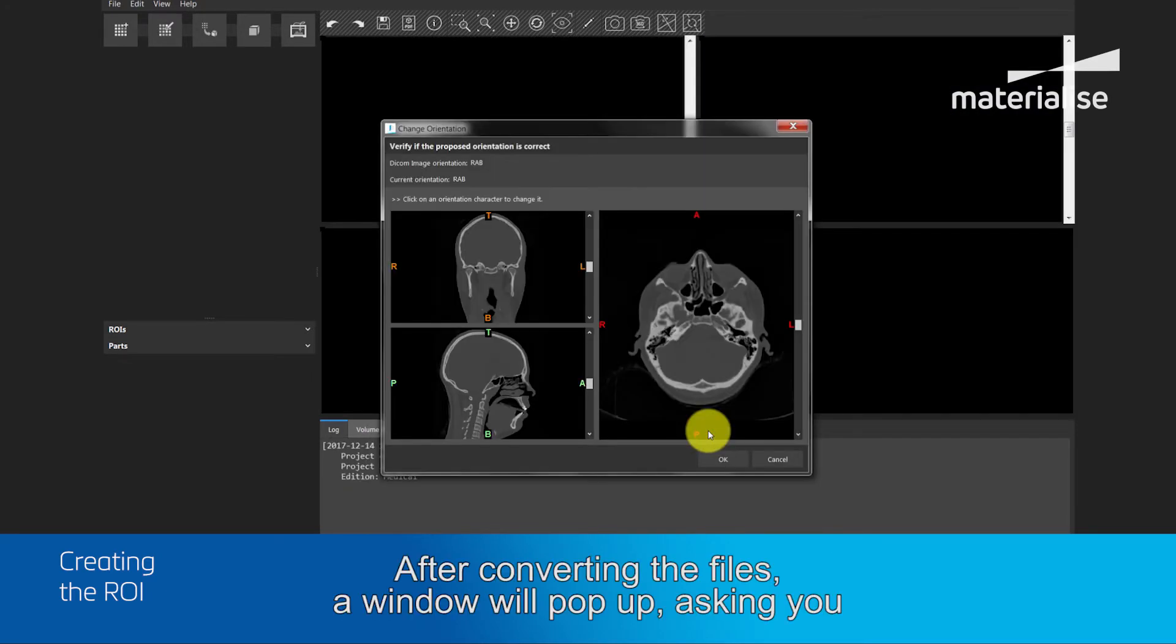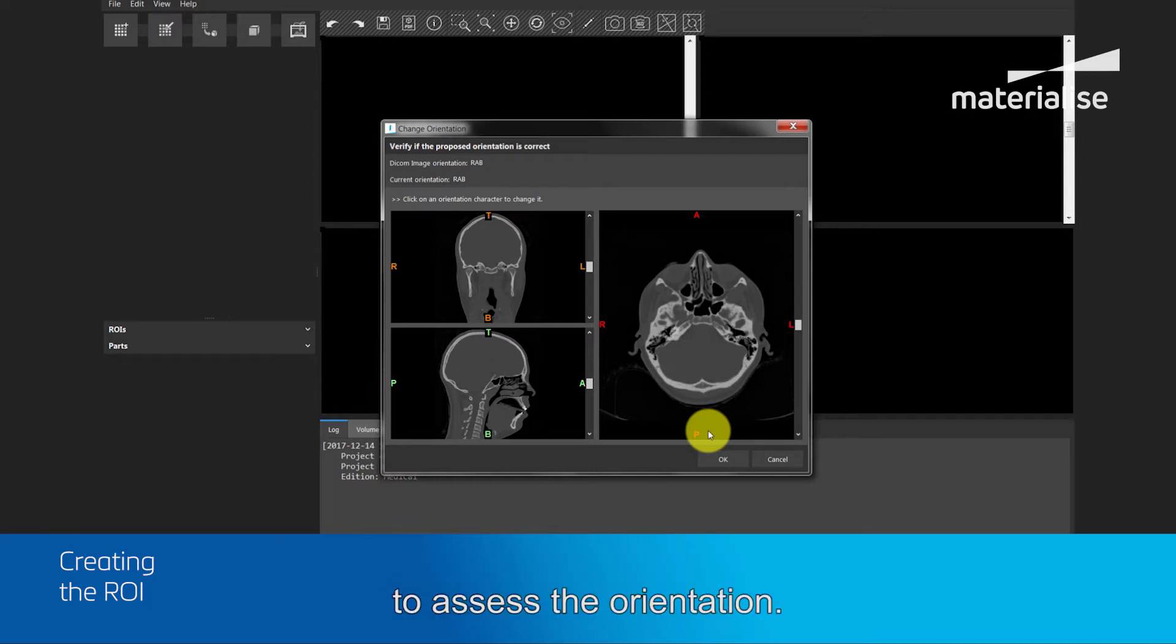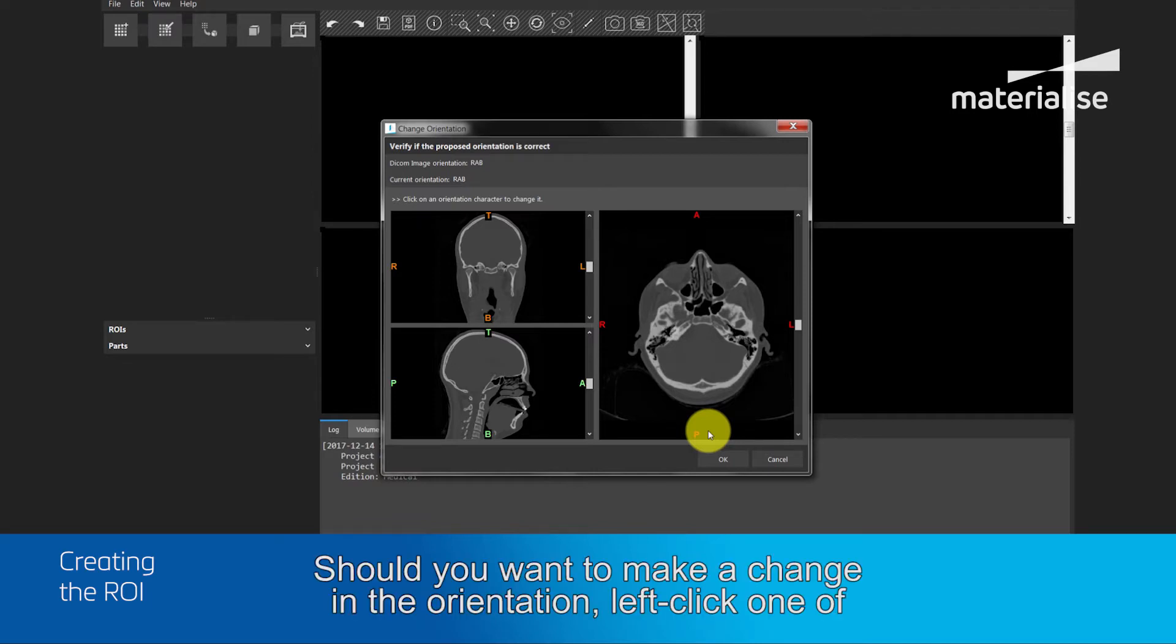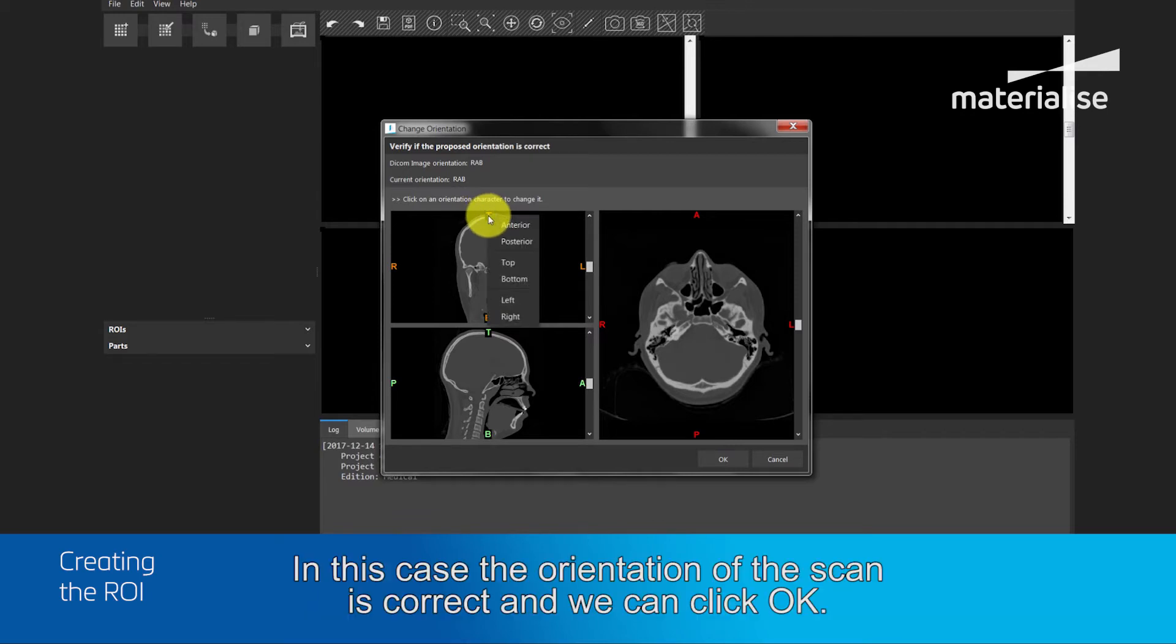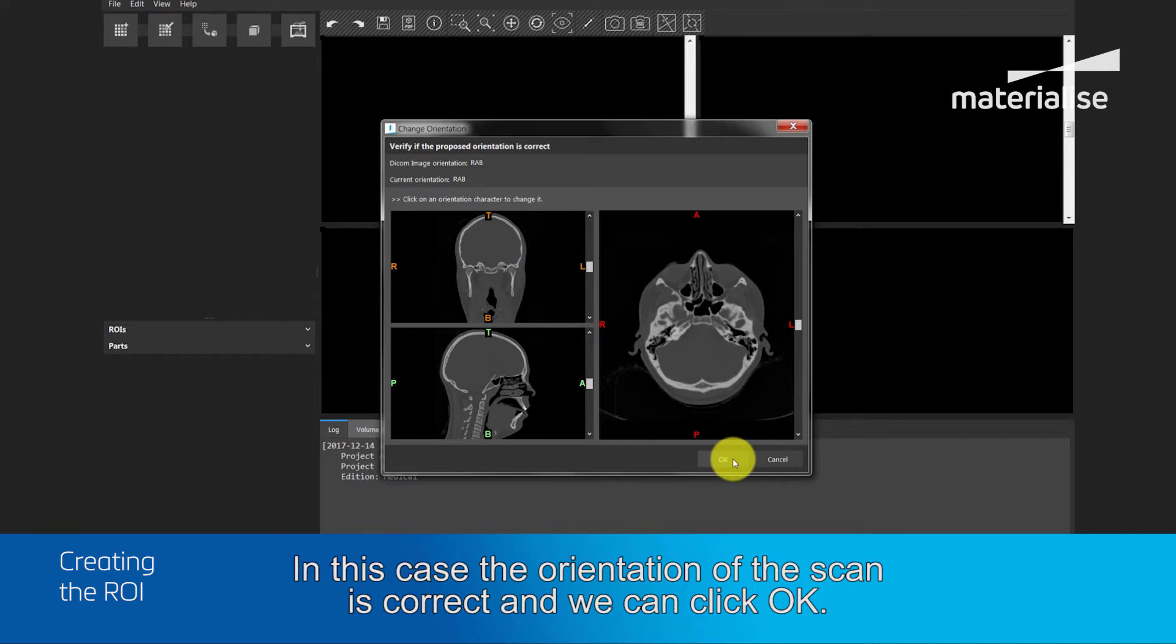After converting the files, a window will pop up, asking you to assess the orientation. Should you want to make a change in the orientation, left click on the letters and choose a different option. In this case, your orientation of the scan is correct and we click OK.